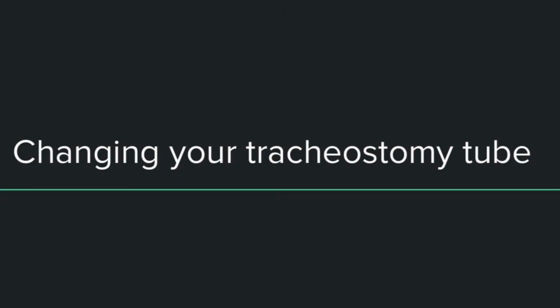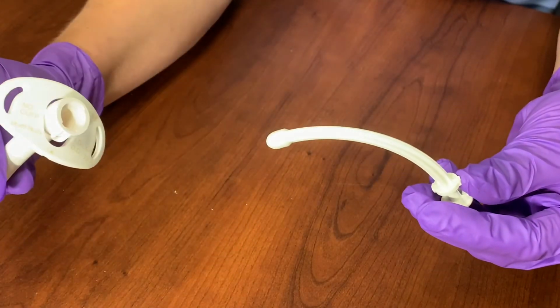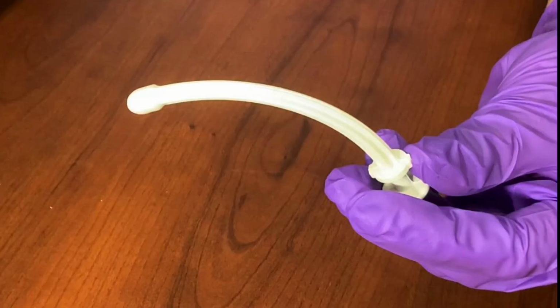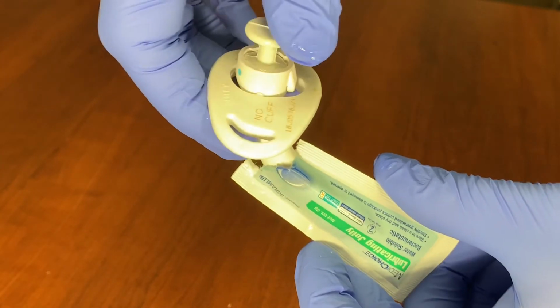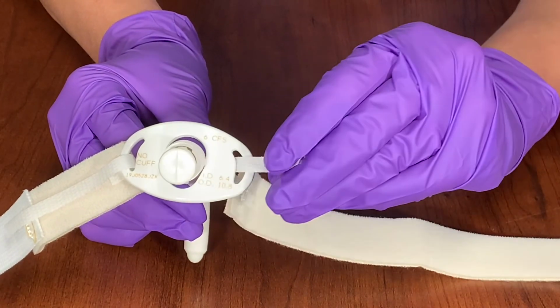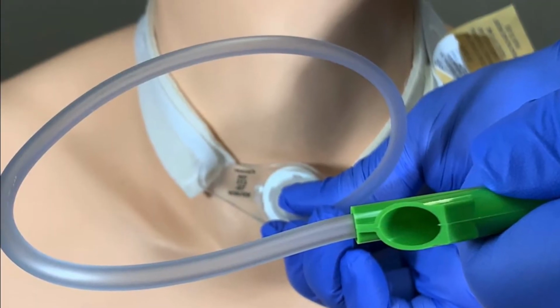When preparing to change it, make sure the new tracheostomy tube is ready. You will want to have the obturator, which is a curved plastic piece with a rounded tip, inside the tracheostomy tube. The obturator allows for easier insertion of the tube into the stoma as it has a narrower profile. Lubricating the tip of the tracheostomy tube can help facilitate an easy change as well. Placing both sides of the Velcro ties on the flange can make it easier to attach the ties after the change. It is important to suction your tracheostomy tube prior to changing it.